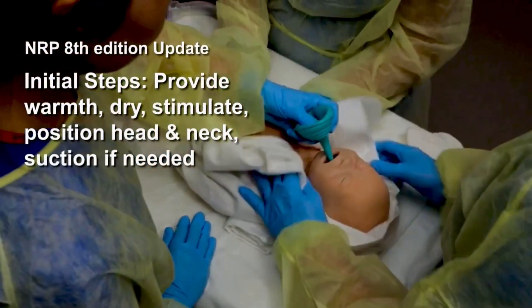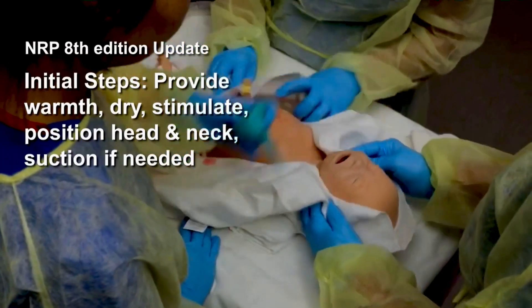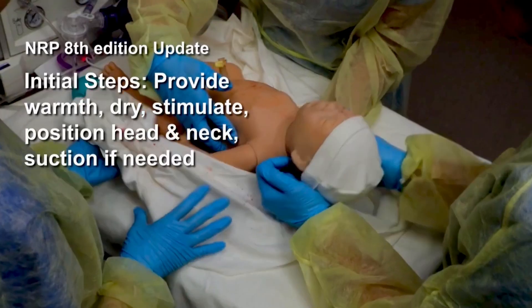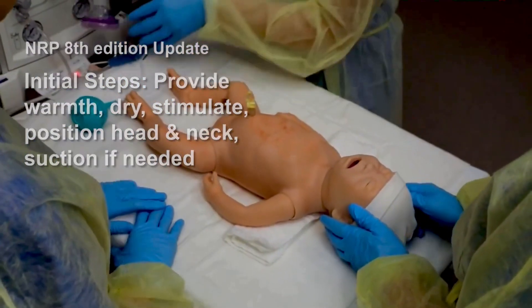Her mouth and nose are suctioned in anticipation of positive pressure ventilation. She's dried, the wet linen is removed, and her head is positioned to open her airway. Despite these initial steps, she remains apneic.